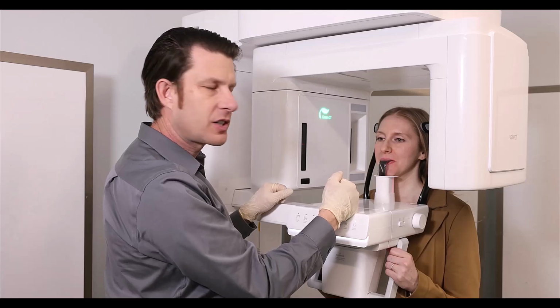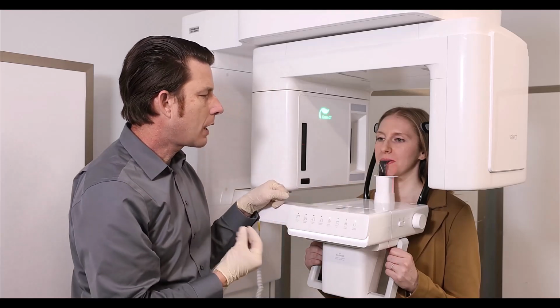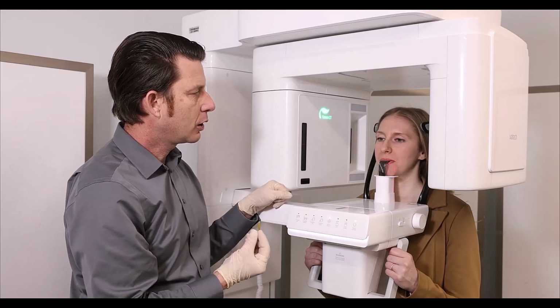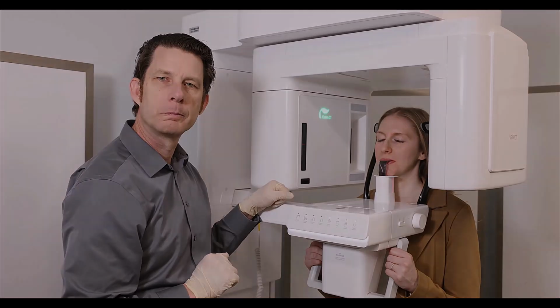Once we have that positioned, we're going to go ahead and have our patient close your lips around the bite stick. Swallow, keep the tongue to the roof of the mouth. Close your eyes. We're going to select Ready Return, and we're going to go ahead and step out of the room.